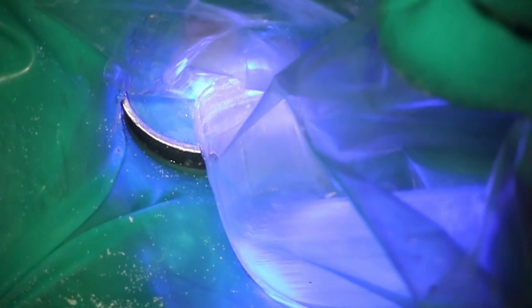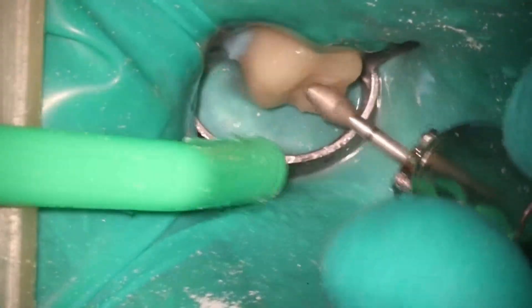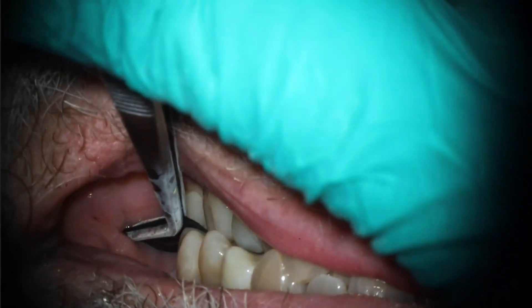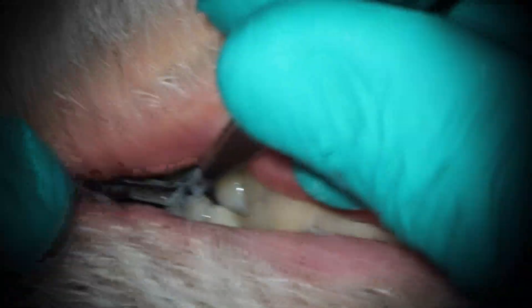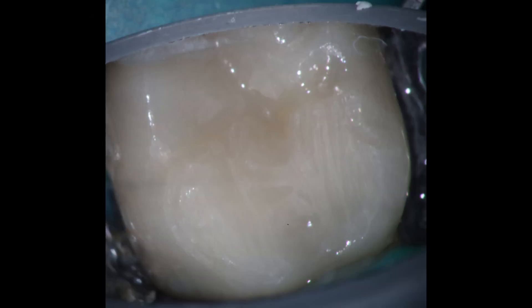I thought this was cool because it shows one of the benefits of the GentleWave. One of the reasons I decided to go ahead and purchase the machine was because I did a quick informal study, looking back at all the cases I did in October, and realized it would have a benefit in about 40% of the cases, allowing me to finish in a single visit versus two, and I would have probably used it in about 67%. Check out that cool anatomy — that little lateral coming through there — and you can barely even tell we did anything on the final x-ray.